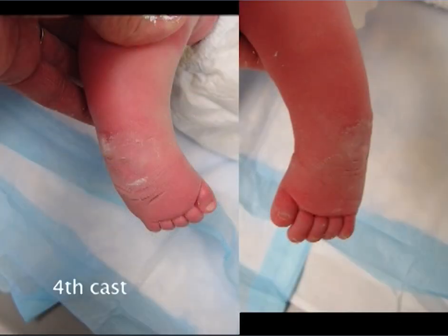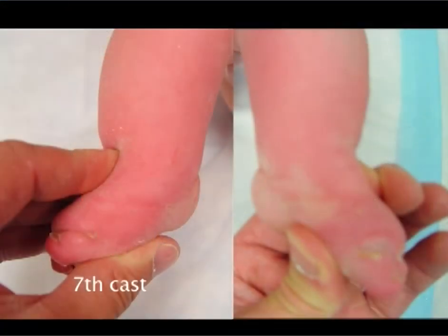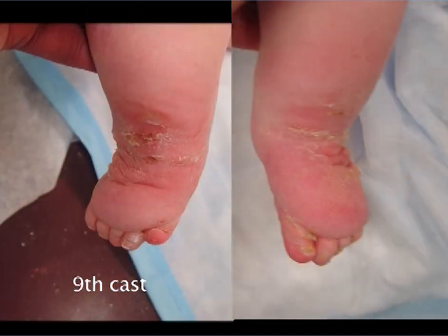In the fourth cast, the foot slipped up further, folding and damaging the skin and causing the cavus to increase. The foot was now in line with the leg and easily slipped up. Manipulations to improve the cavus failed. A tendo Achillis tenotomy at 2 months of age did not prevent the foot from slipping up inside the cast. The skin was damaged and the cavus increased. The foot was stunted.